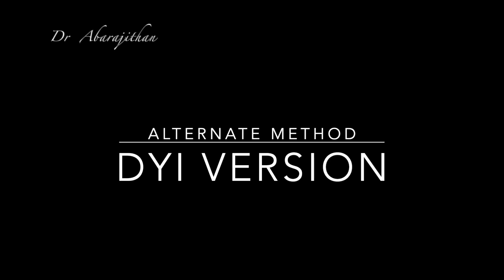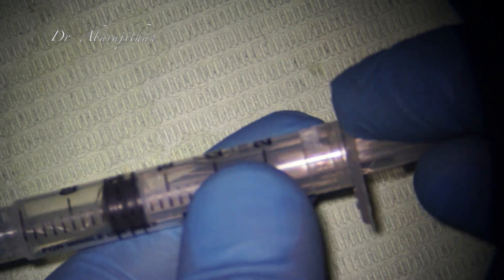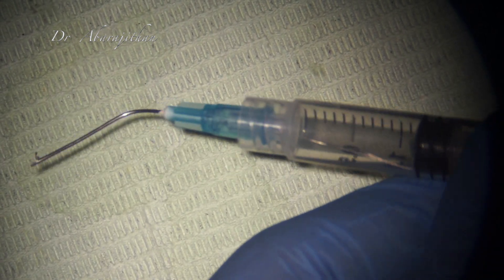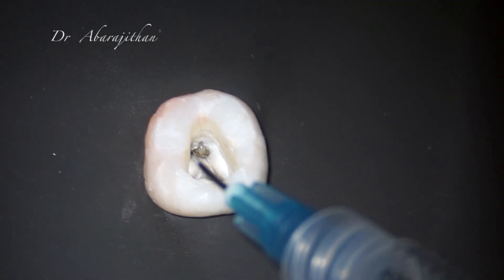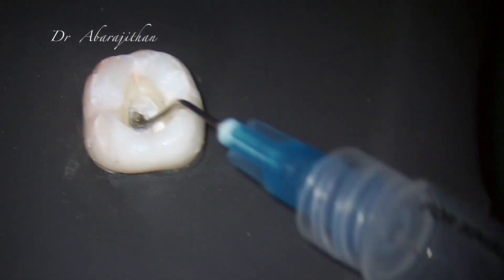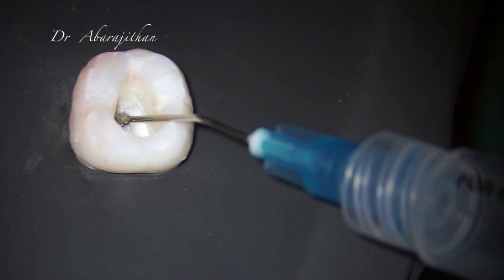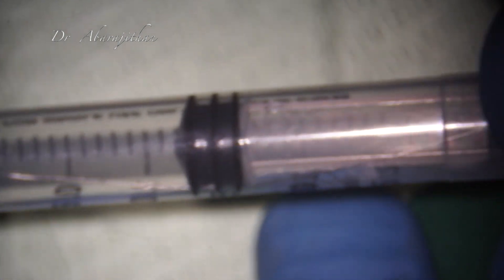Now let me show you a do-it-yourself version which can be an alternative to this ICR system. This can be fabricated in your own practice. All you need is a 23-gauge needle, a Luer-lock syringe conventionally used for administering local anesthesia, and ligature wire with which you can form a loop. Since the ligature wire is secured to the plunger of the syringe, when you withdraw it, it tightens the loop. This can also be used to remove instruments that have already been loosened using ultrasonics.